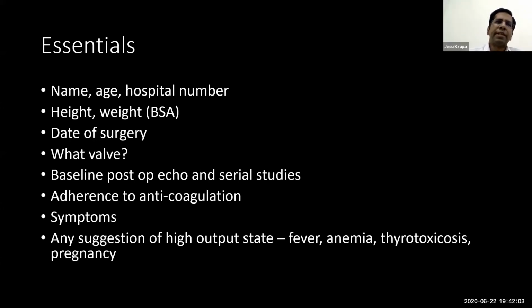And also whether the patient has been taken anticoagulation is also very important, because somebody who is on a metallic valve has stopped anticoagulation is likely to develop thrombus or blood clot, and is likely to develop an obstruction. So that history is also very important, especially when we see high gradients, and especially if the valve is not very old, like it's just a few months and the patient is symptomatic, patient has stopped anticoagulation, we think of a thrombus.